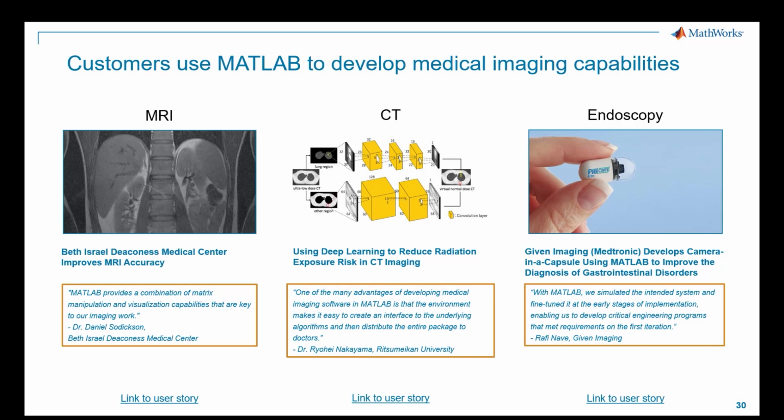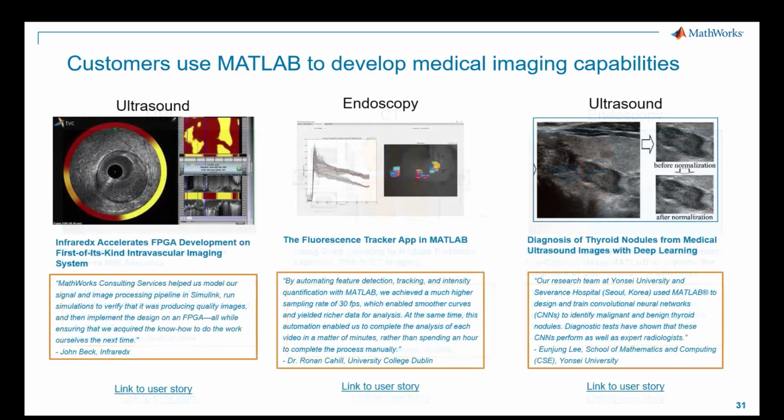Finally, here are some user stories showing how some of our customers are using our tools. Beth Israel Deaconess improved the accuracy of their MRIs using our tools, and Given Imaging developed the pill cam using MATLAB. Here are a few more user stories to wrap things up.